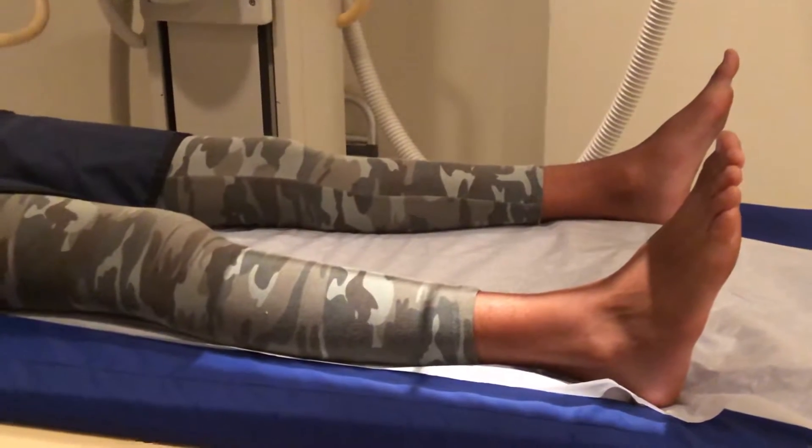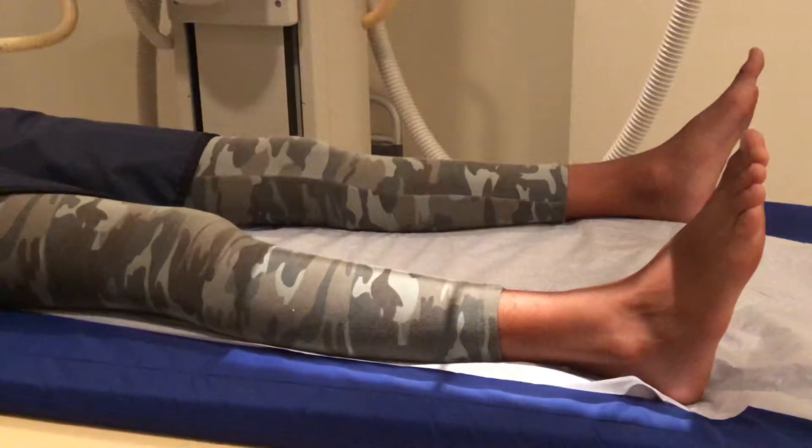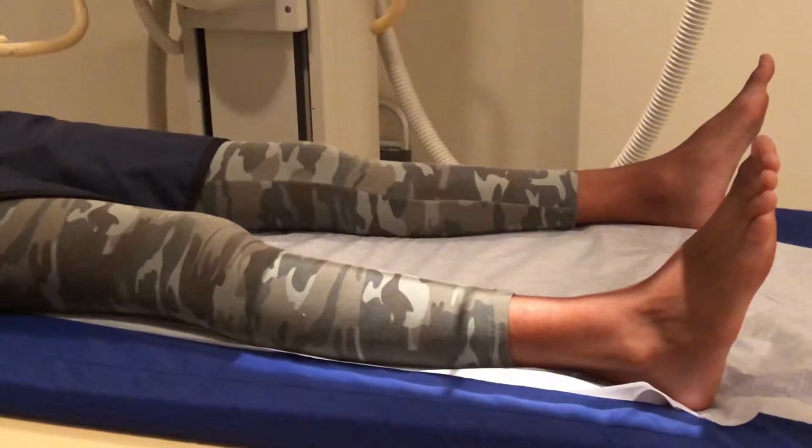Hi, you clicked on this link because you want to know how to take an x-ray of the tib-fib, and I'm going to show you how to do it perfectly every time.